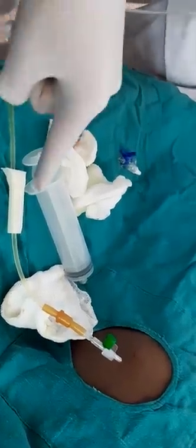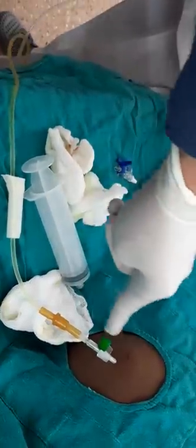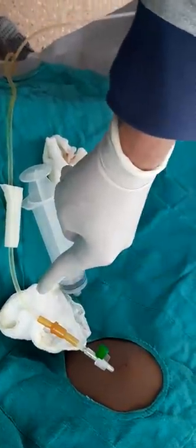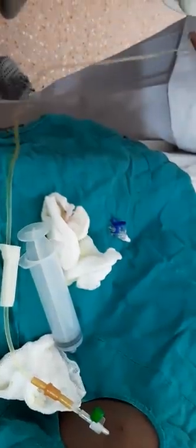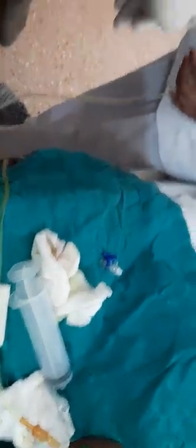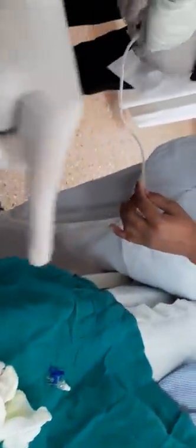Now we will connect this — as you can see, the fluid has started coming out. As you can see, the fluid is getting collected into the bottle. Now we are taking the samples; the sample is getting collected.